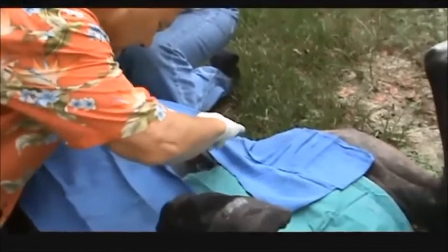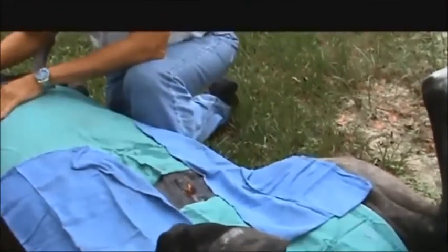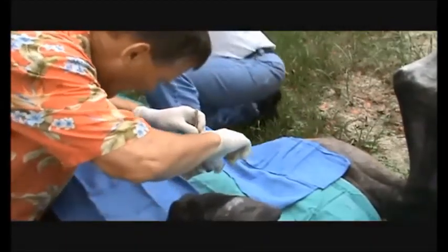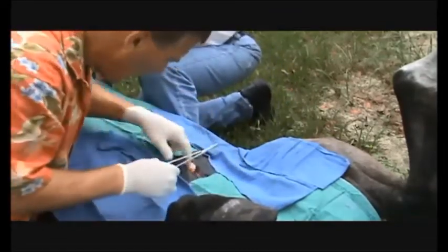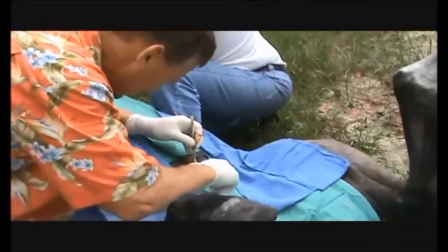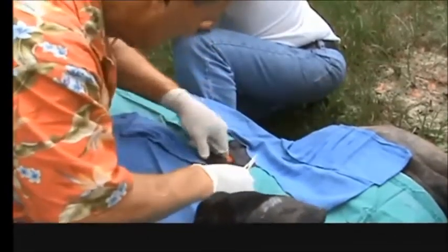He's starting with a fusiform incision, so a football shape that comes to a point. It's really hard to close a circle. And he's going to trim off the skin and any loose tissue that would get in the way of a nice secure closure. You can aid the anesthesia on this with a ring block around the umbilicus. Again, he's trimming. Here he may be trimming the edges of the ring to freshen them up.